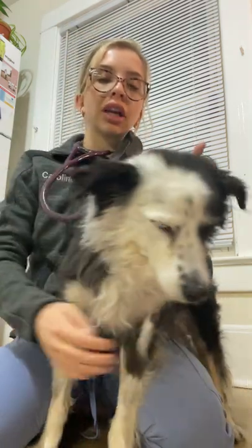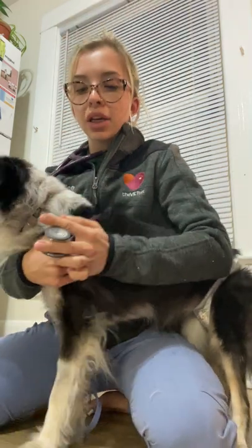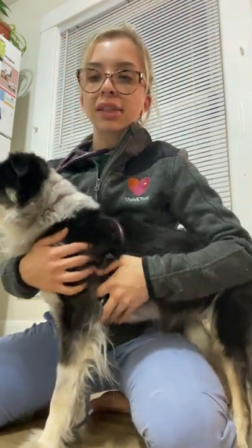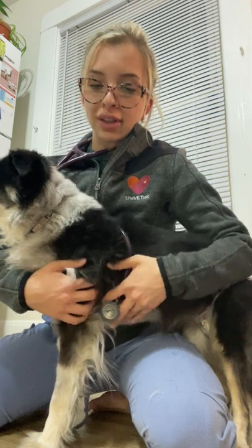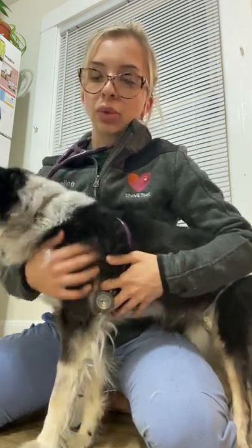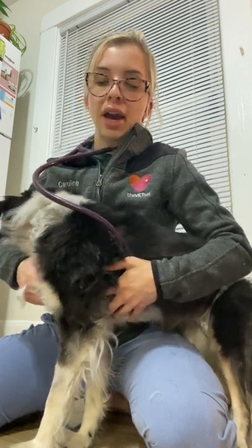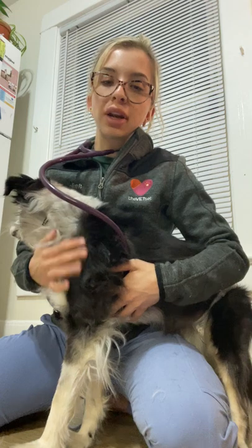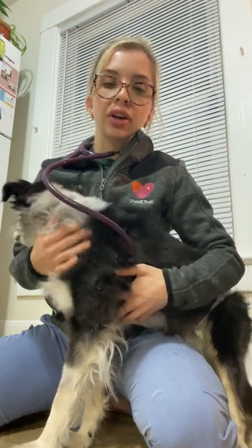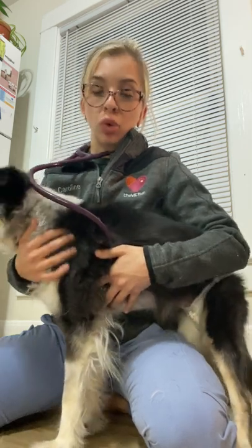We're going to be working on the left side for the first three valves. Taking my stethoscope I'm going to go ahead and place that right between the second and fourth intercostal spaces, just above the sternum, and I'm going to go ahead and listen for ten to twenty seconds to hear hopefully normal cardiac sounds but also listen out for anything abnormal.